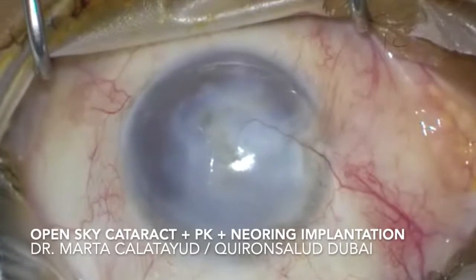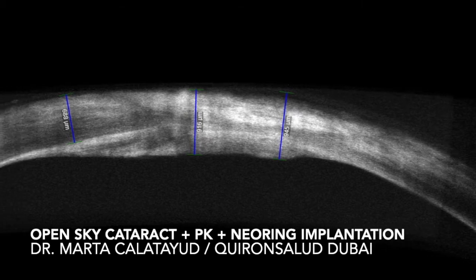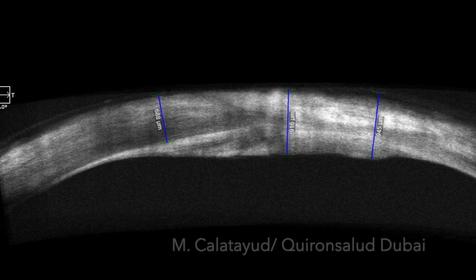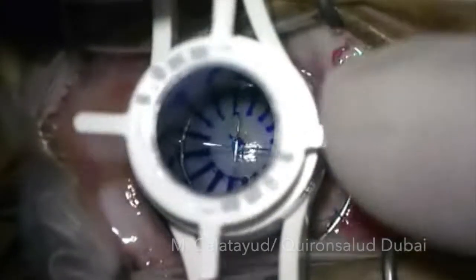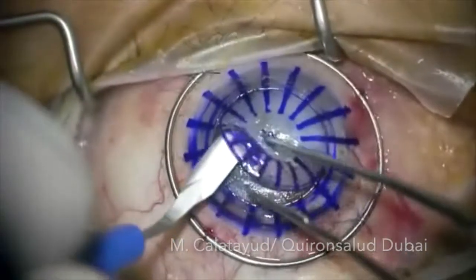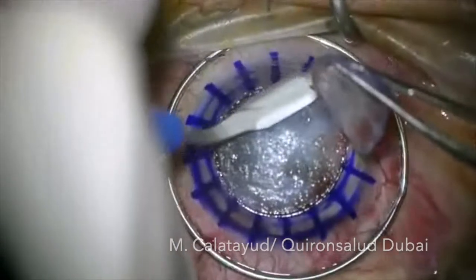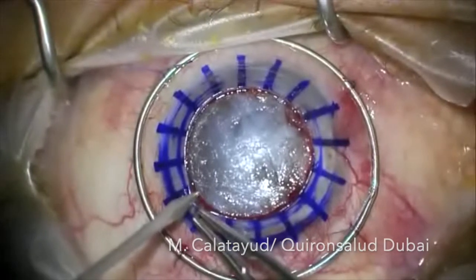We have a one-eye-only patient with this corneal scar, and he presents with reduced visual acuity, so we suspect there is a cataract. Looking at the OCT, there is an interface, so we will try to do a capsulorrhexis with a lamellar keratectomy if the deeper stroma is clear. As you can see, it's not clear, so we go to plan B.